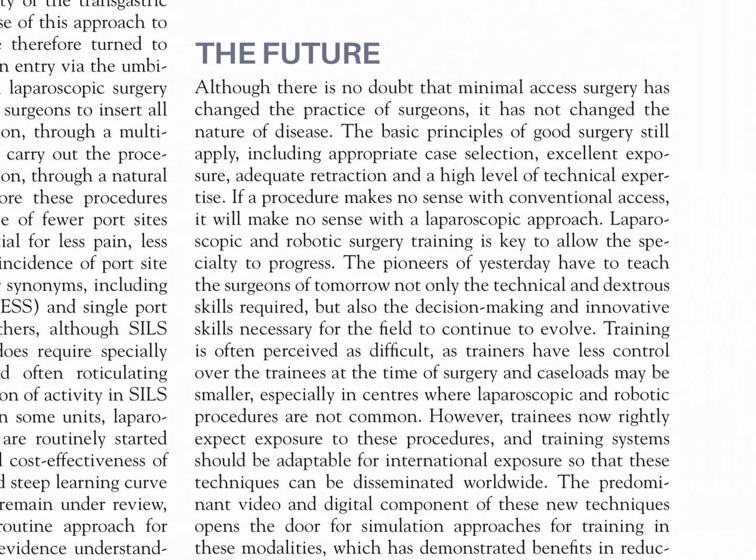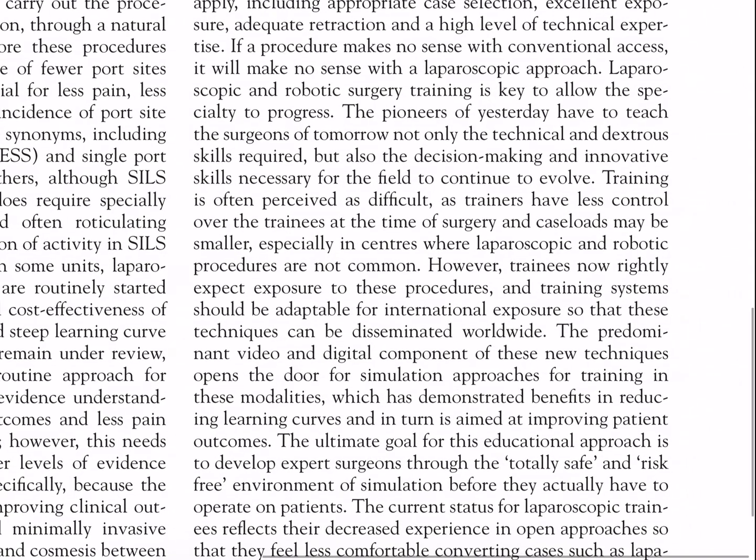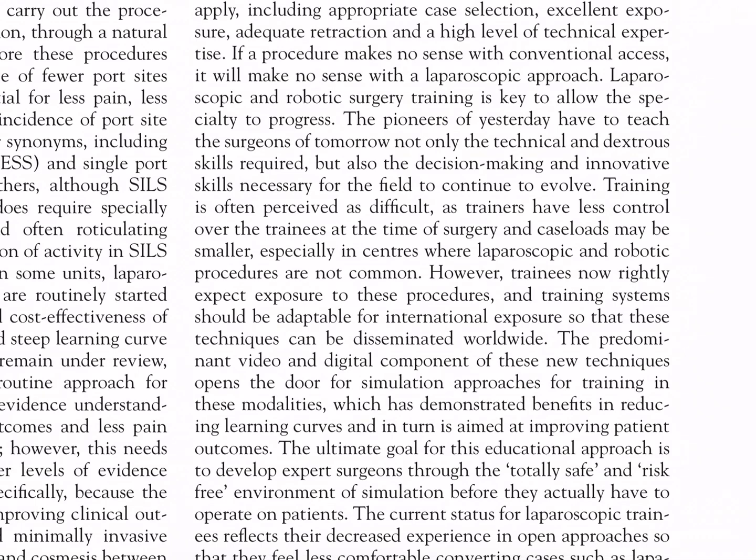Training is often perceived as difficult as trainers have less control over the trainees at the time of surgery and caseloads may be smaller, especially in centers where laparoscopic and robotic procedures are not common. However, trainees now rightly expect exposure to these procedures, and training systems should be adaptable for international exposures so that these techniques can be disseminated worldwide.